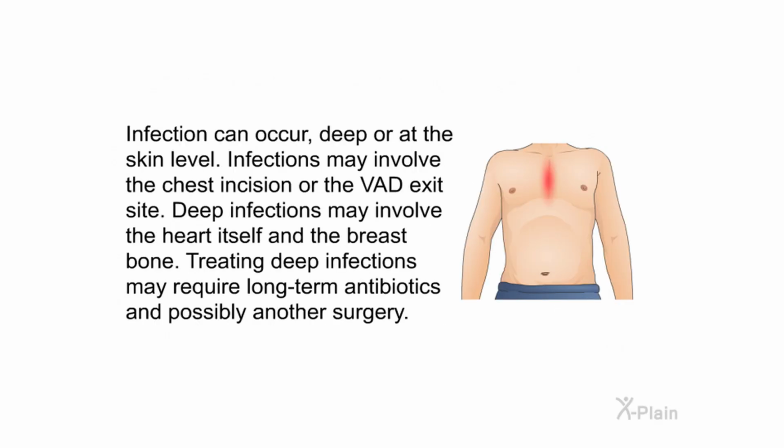Infection can occur deep or at the skin level. Infections may involve the chest incision or the VAD exit site. Deep infections may involve the heart itself and the breastbone. Treating deep infections may require long-term antibiotics and possibly another surgery.